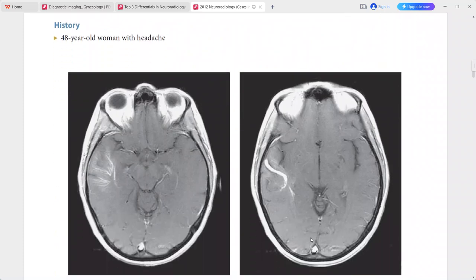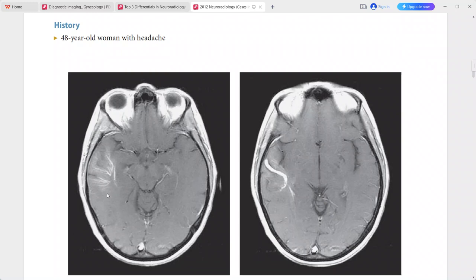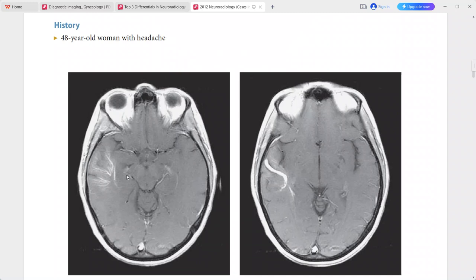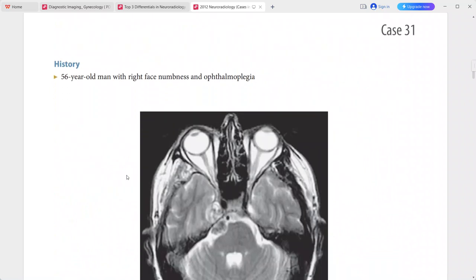Next case: 48-year-old woman with headache. Post-contrast T1 shows an intracerebral complex of enhancing curvilinear vascular structures in the right temporal lobe, coalescing to form a large vein that passes through the cerebral parenchyma to drain superficially. This is a case of developmental venous anomaly (DVA). AVM can be included in the differential.